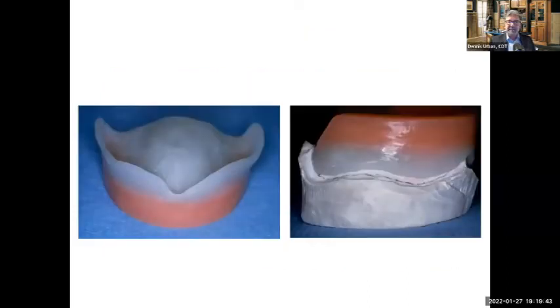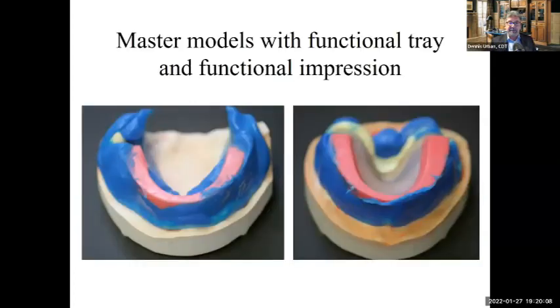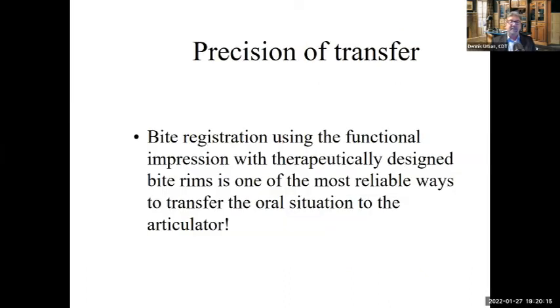This is the denture base plate and occlusal rim for a functional impression and bite — making a custom tray with wax, contouring it so you can border mold, take an impression, then if using PVS material, take it out of the mouth and contour the wax a bit, put it back in the mouth, and also get an accurate bite registration at the same time. That eliminates one visit. This is the master model with the functional tray and impression. The bite registration using the functional impression with therapeutically designed bite rims is one of the most reliable ways to transfer the oral situation to the articulator.